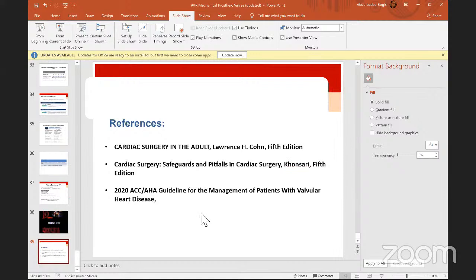Any other question? Same as your question, Faisal. I asked the same question to multiple surgeons. As Dr. Muhammad Rifai said, it's about the preference of the surgeon. Many of them will start, as he said, from the left, then go to the right coronary, then the non-coronary, then finish all the sutures. You can tie down by just tying or use the Cor-Knot device as well. It's been used in multiple centers. They use it a lot, in some centers, not all the centers.